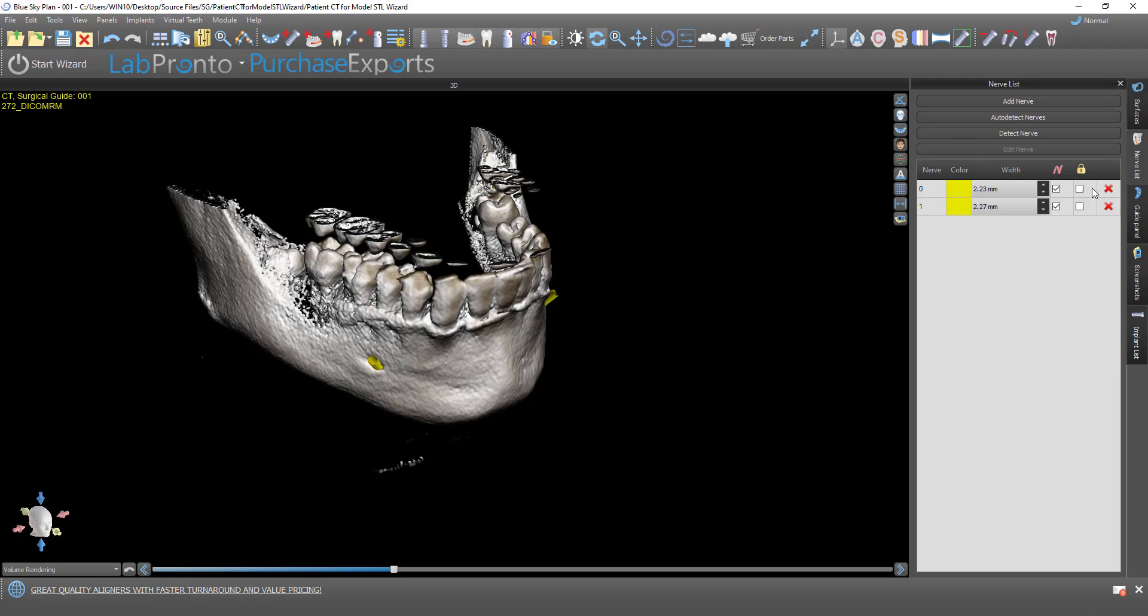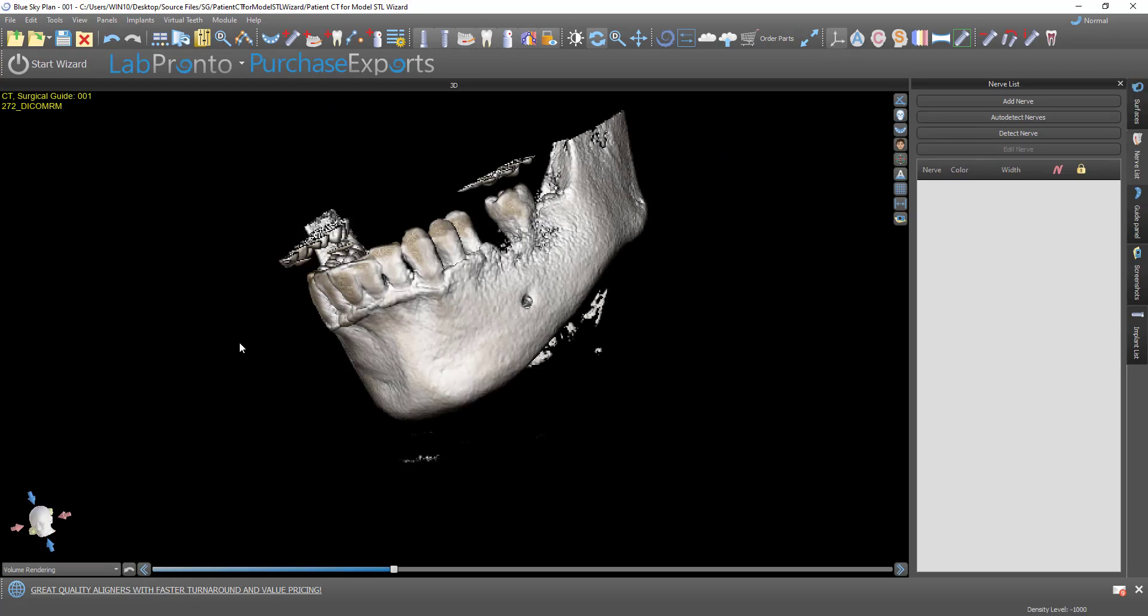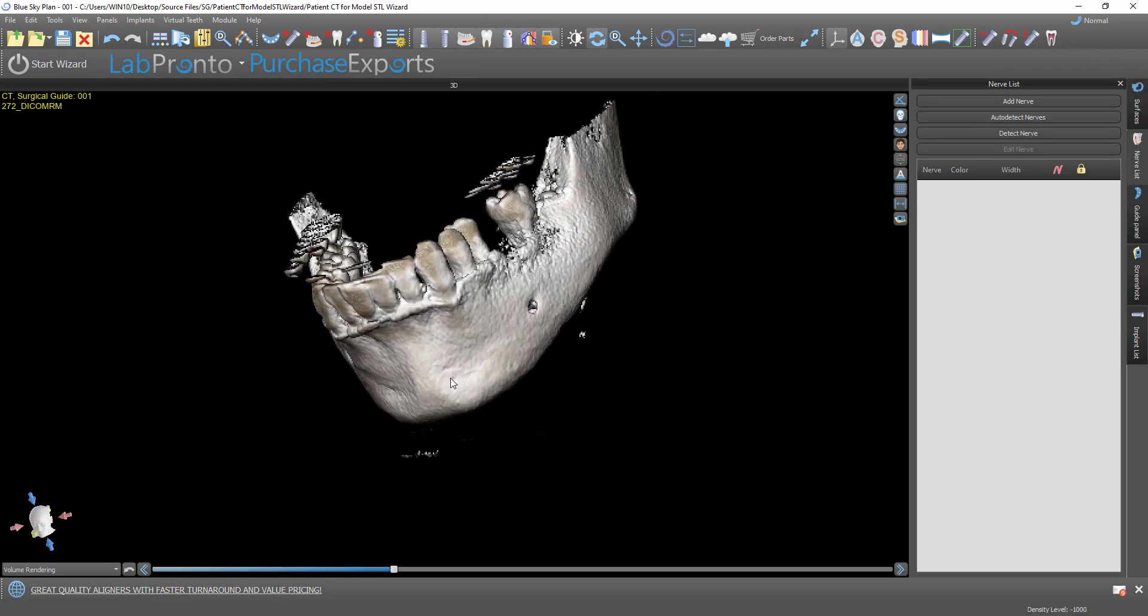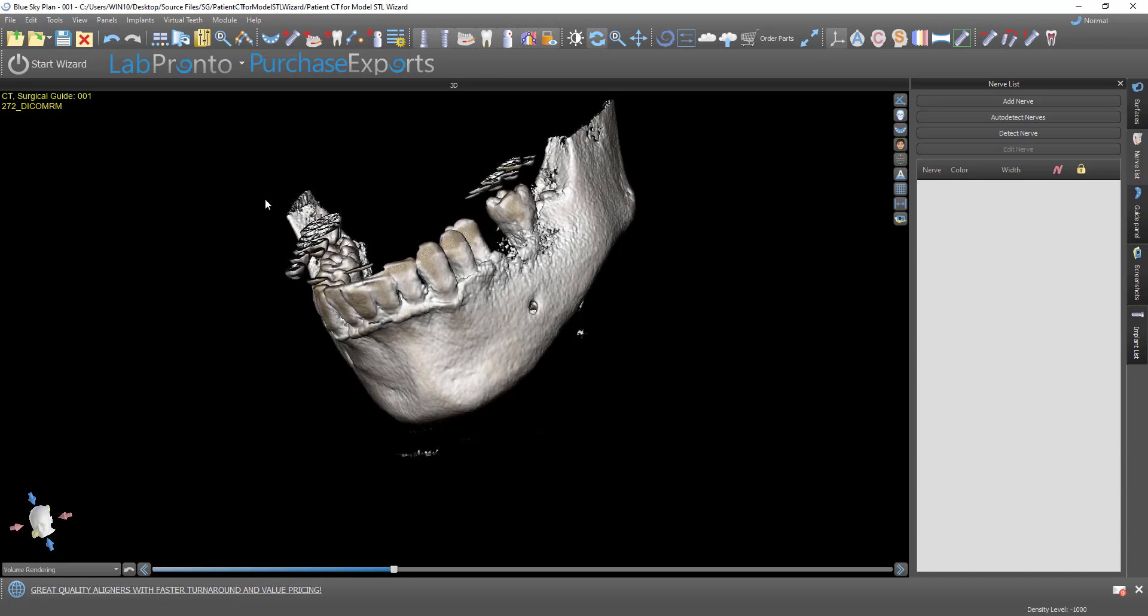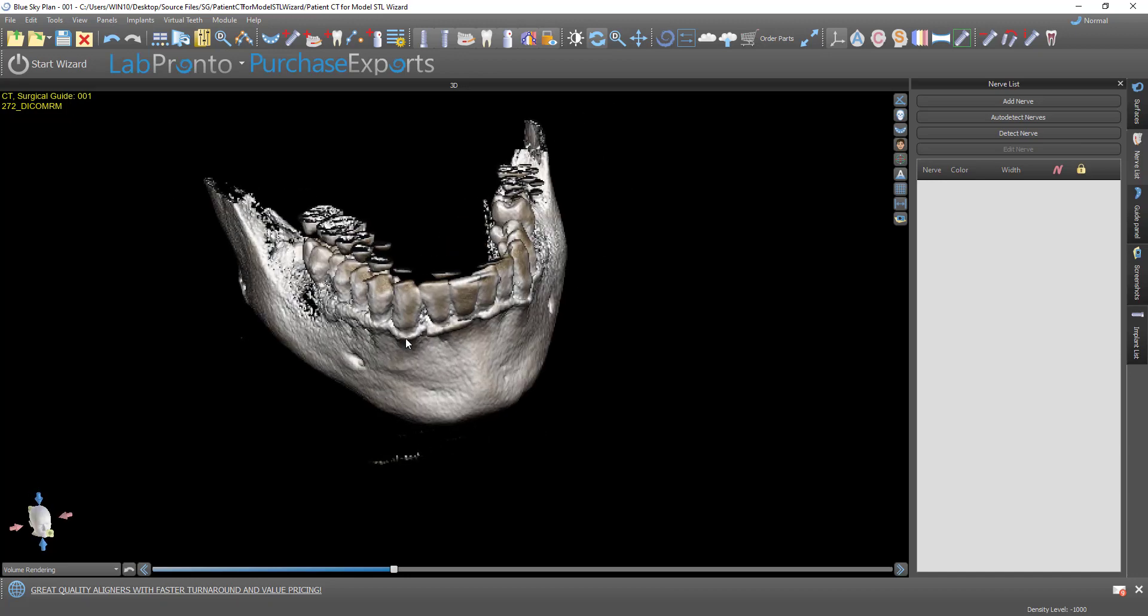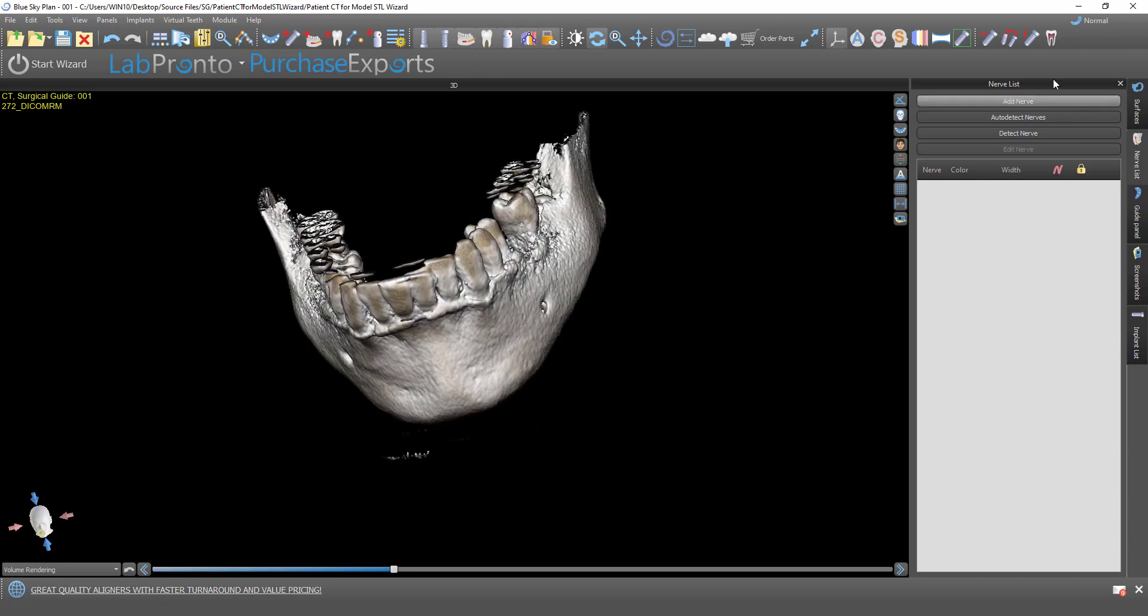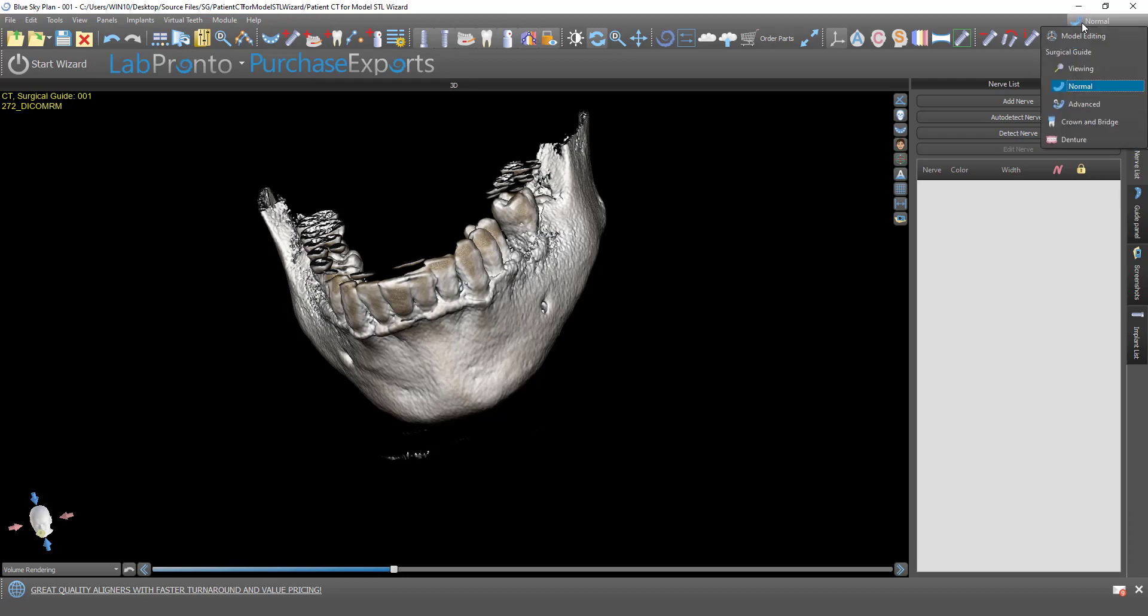I'll go ahead and delete these nerves. So now we have our DICOMs imported, just like we would import our DICOMs. We have our Nerve panel. Right now I'm in Normal mode, but it works exactly the same way if I switch to Advanced.